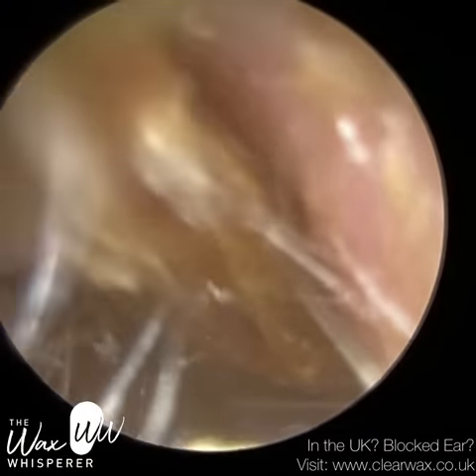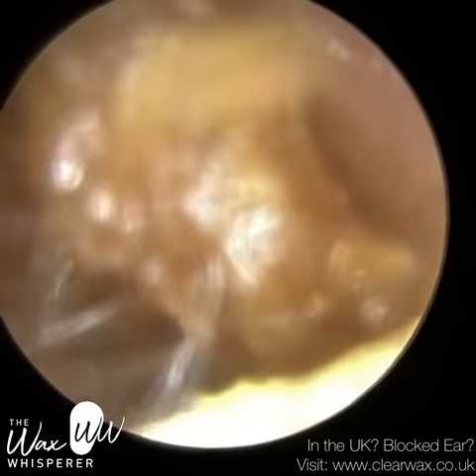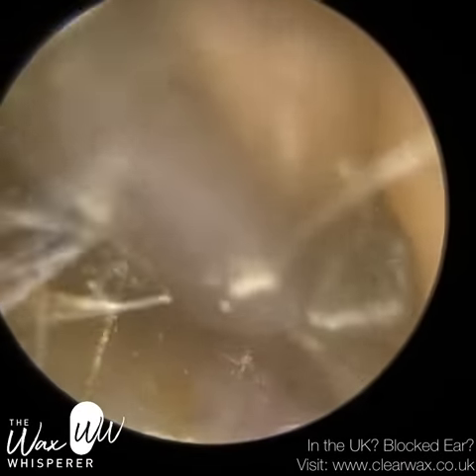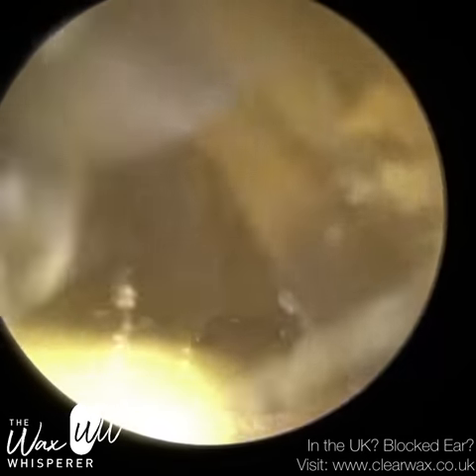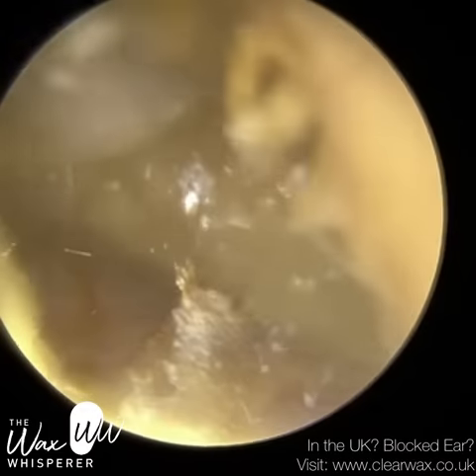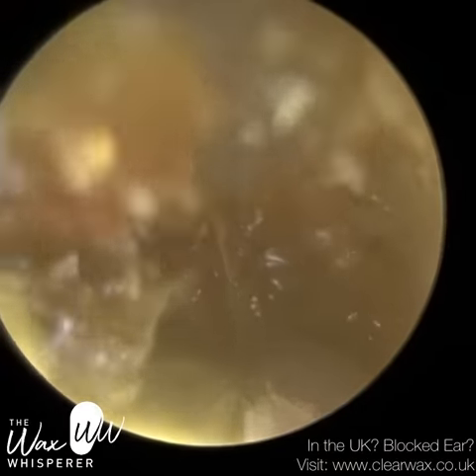Whilst you're watching me removing the wax, I'll explain what a retracted, sucked-in eardrum is and how it's caused. Behind the eardrum we have what we call the middle ear — a cavity that should be air-filled. Ideally, the air pressure in the middle ear cavity should be equivalent to the air pressure within the ear canal and therefore the atmosphere. When the air pressure is equal either side of the eardrum, that's when the eardrum is most mobile and vibrates the most in response to sound waves.